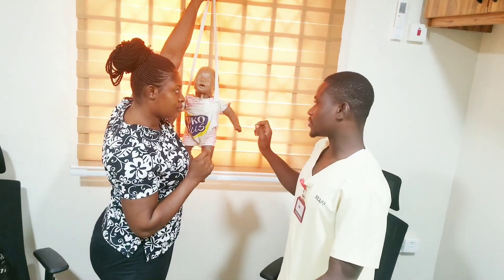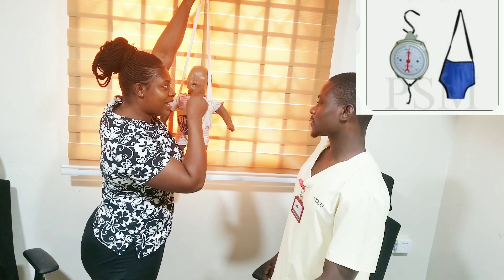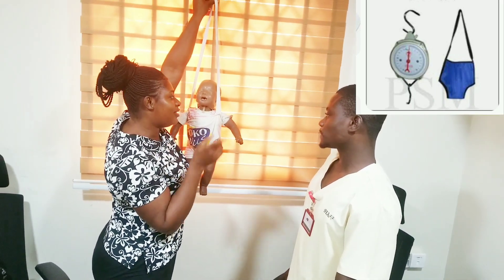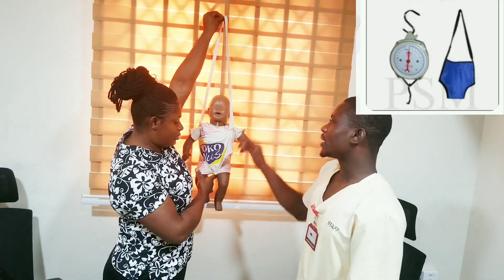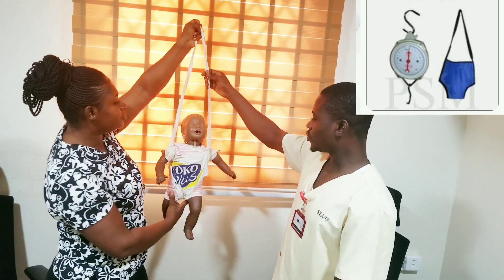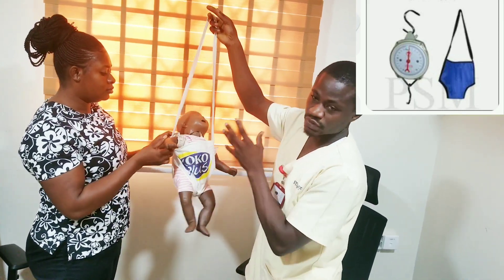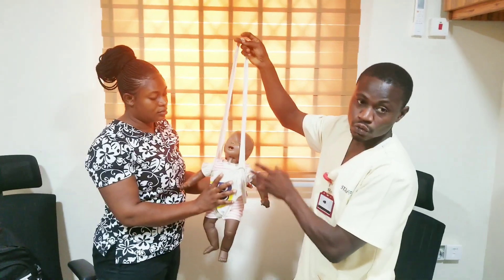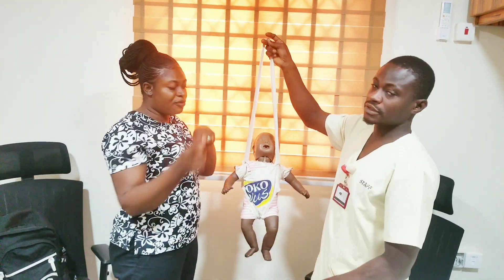On your screen is an image of the Salter hanging scale. We don't have one here, which is why we are doing this demonstration. Normally we check whether the scale is working well by placing a known object on the Salter hanging scale to verify it before use.